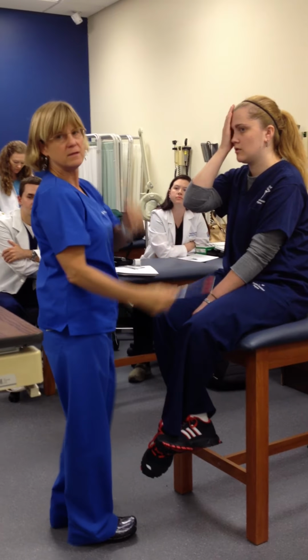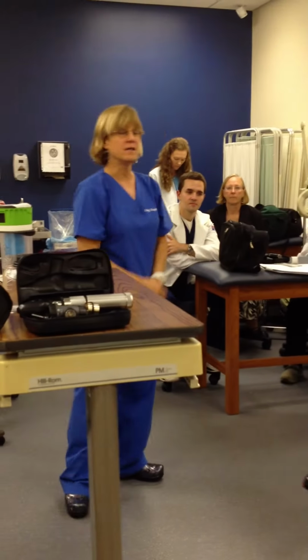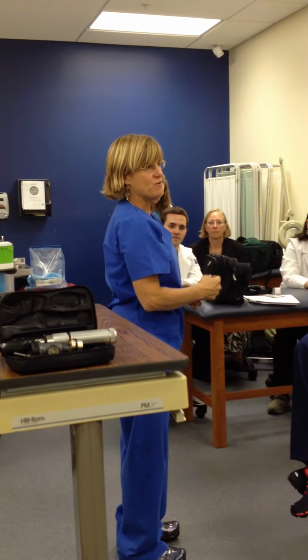But is it all right with using 2 fingers? Absolutely fine. Yeah, either way. Just watch getting your arms in front of them. You kind of want to just keep your fingers there. That's why when you saw me go like this way, I'm trying to keep my elbow out. I have this hand over my eye.